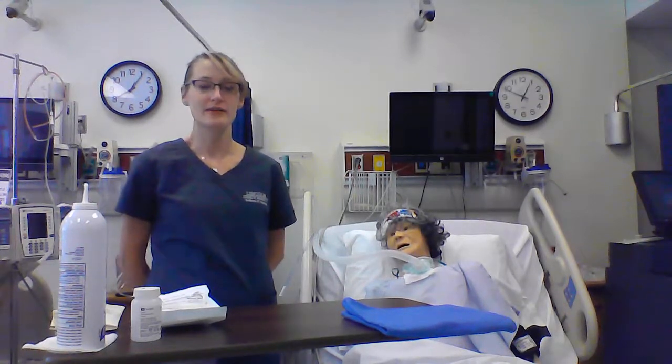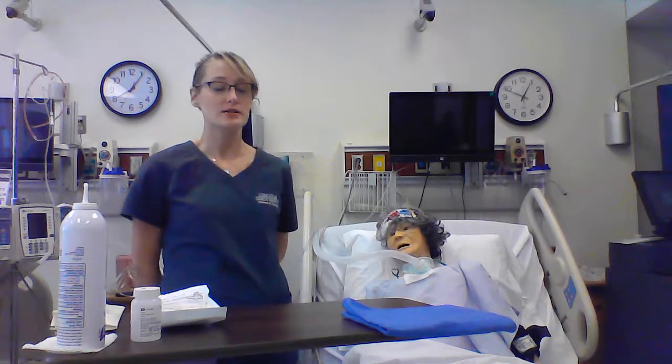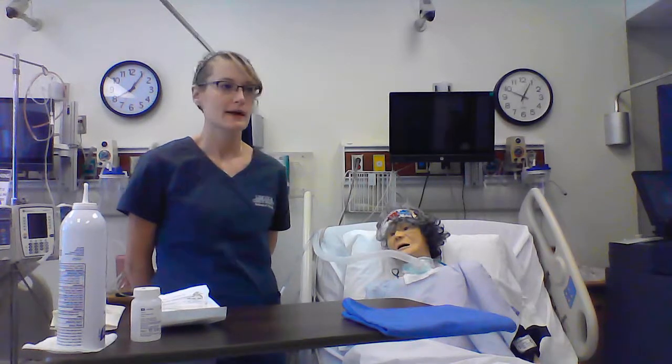My name is Tracy Cundit. I'm a 7th semester nursing student, and today I will be providing tracheostomy care and suctioning for a patient.